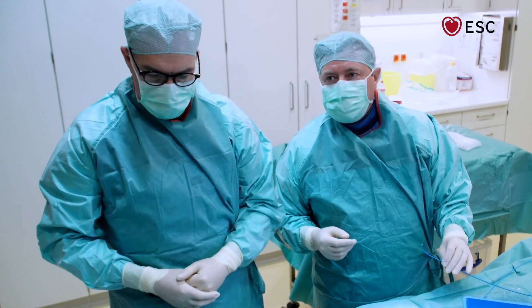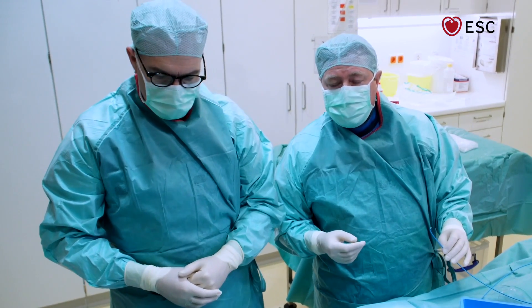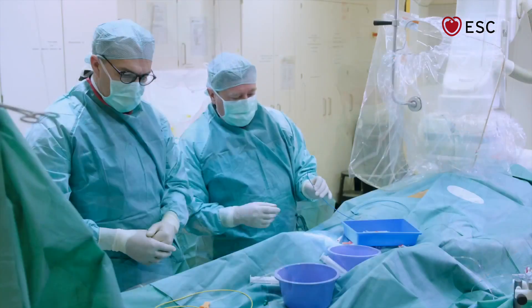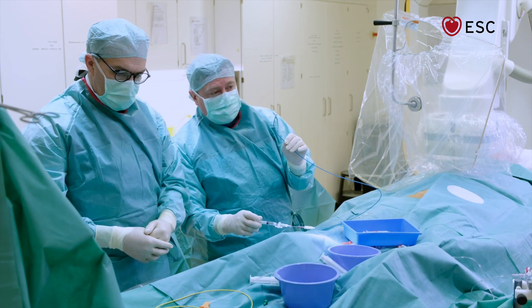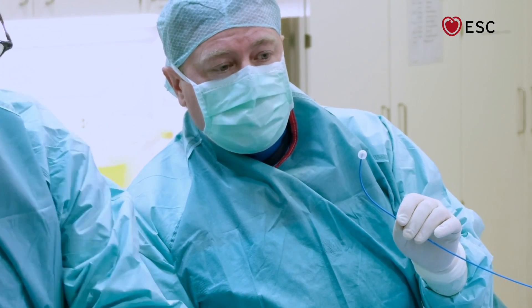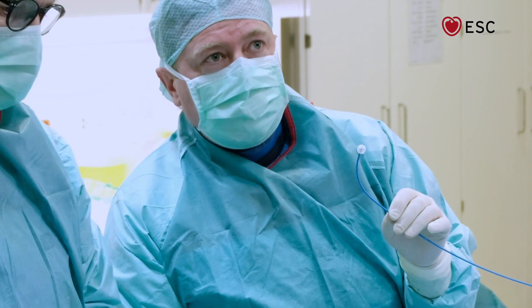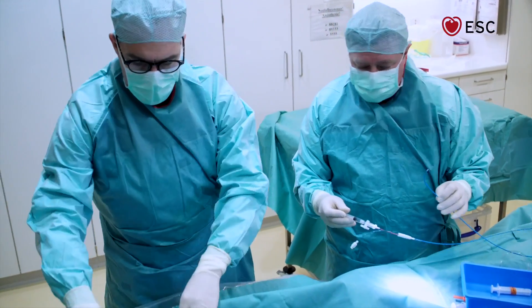For right heart catheterization, we use a catheter that we put through the right heart into the pulmonary artery. We will show you two different catheters. The first has a single lumen and a balloon at the tip — you can blow up the balloon. The balloon is used for two purposes: one is to float the catheter to where it should be, and the other is for measuring the pulmonary arterial occlusion pressure.